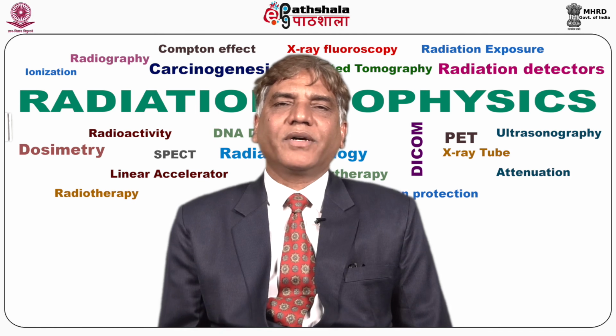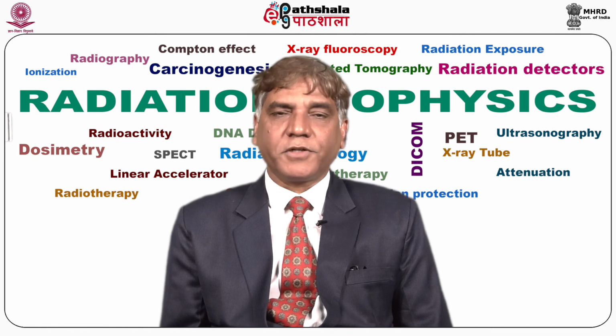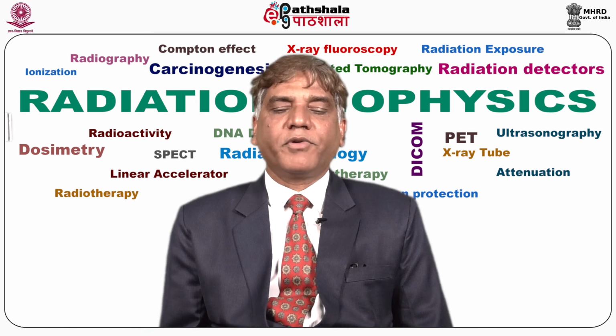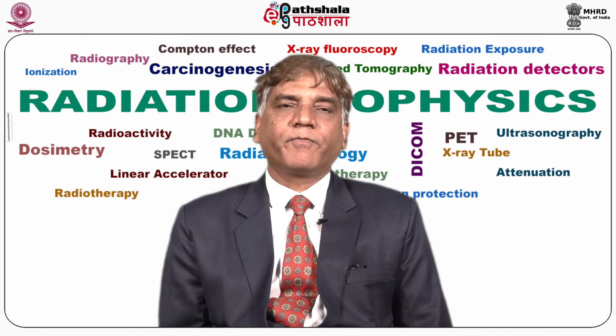Original scanners used 288 detectors. Newer versions of third generation CT scanner used up to 700 X-ray detectors. You can see here both the X-ray tube and detector assembly moved around the patient body, and it is a rotate type because both the X-ray tube and detector are rotating.